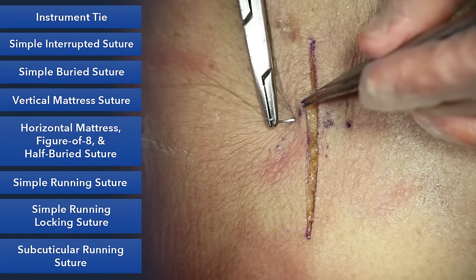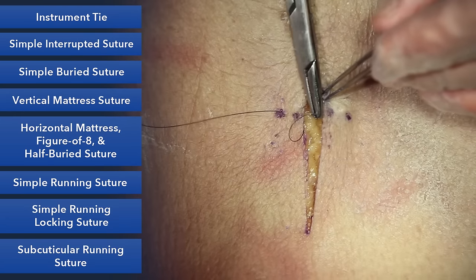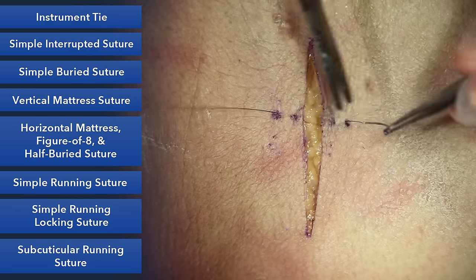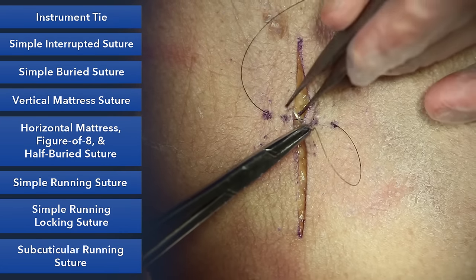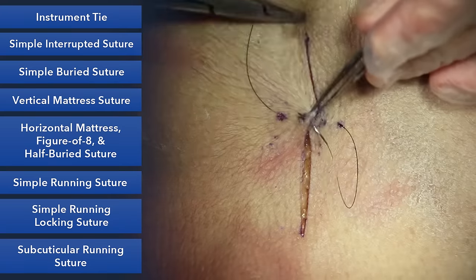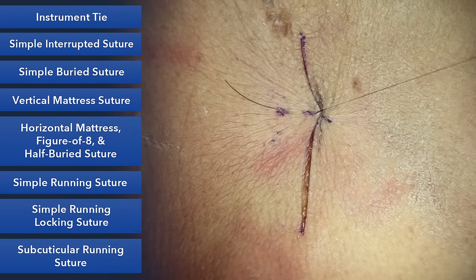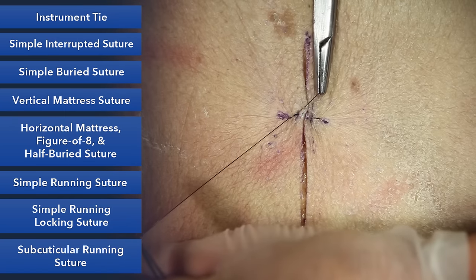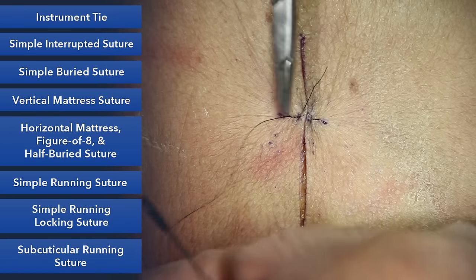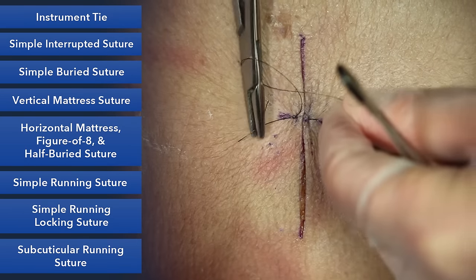So we'll start far and travel under the skin. And the same thing on the other side. And we'll turn our needle around, and now we'll go near and near. And what you'll see when we tie this down is that this approximates and everts the skin edges, and we can make it just as tight as we want. And we have our granny knot, and that'll hold it. And we'll square our knots.